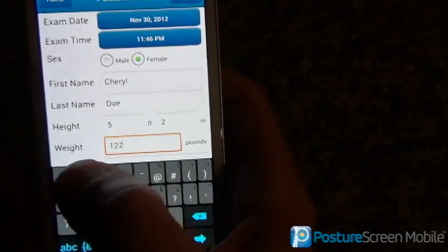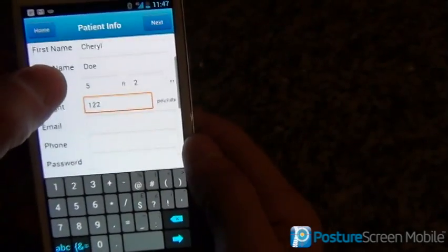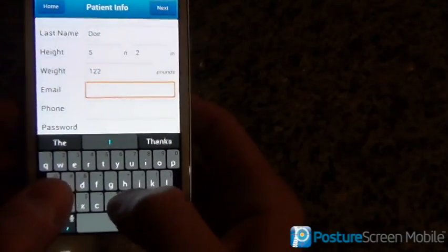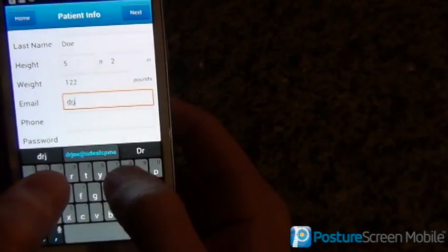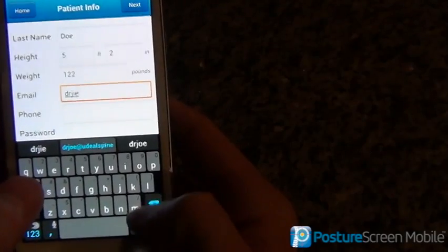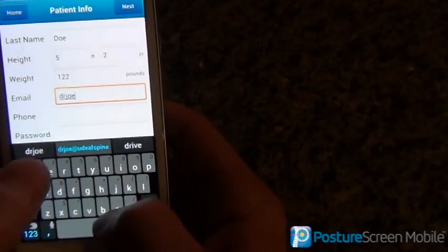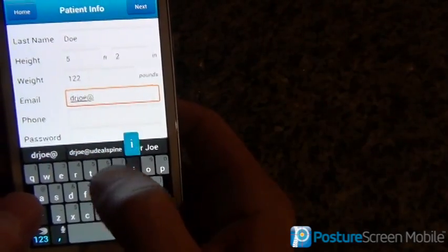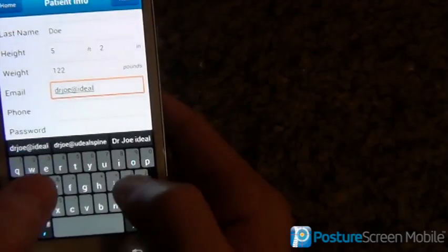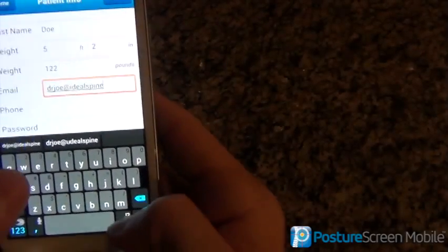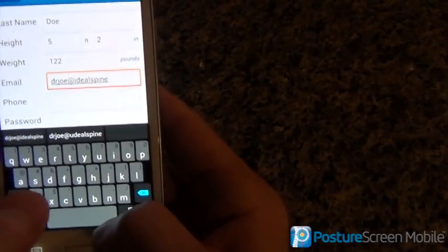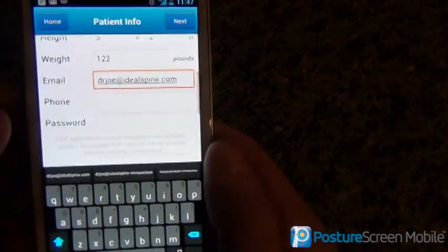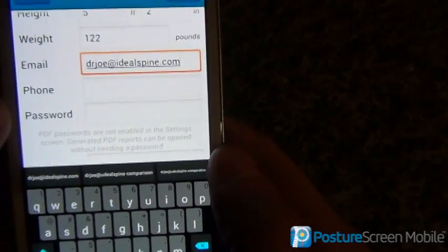Let's go ahead and put her weight. I'm just going to scroll up. We want to put in their email address, so I'm going to put mine in here. Let's go ahead and put my email address. We can put their phone number as well as a password.